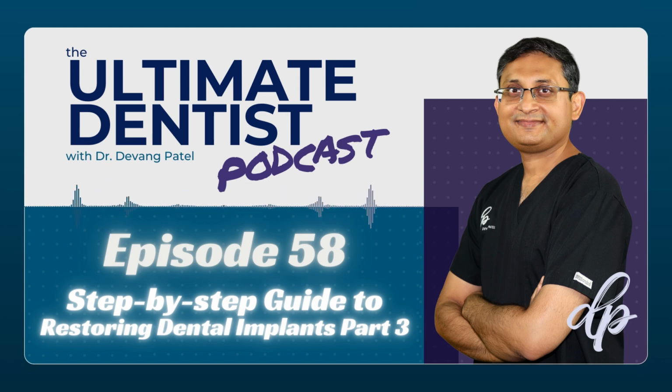A cement retained implant restoration is pretty easy in the sense that you have an abutment which goes into the implant, which can be customized or could be a stock abutment, and then the technician makes a crown which goes on top of it. So what you do is first screw the abutment into the implant. Take the healing abutment out, irrigate as normal with chlorhexidine, then put the abutment in, screw it in, and torque the abutment. I will go through the cementation or fitting of the implant crown in the next episode, so don't worry about that.